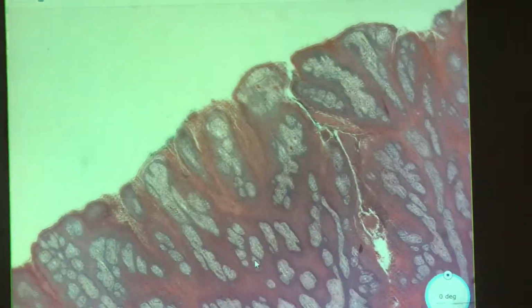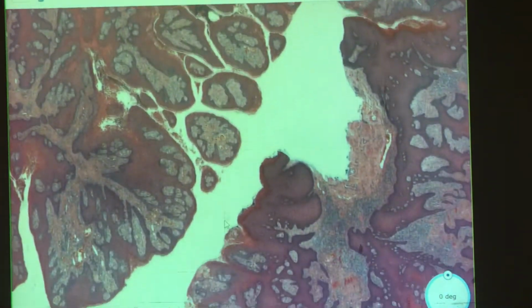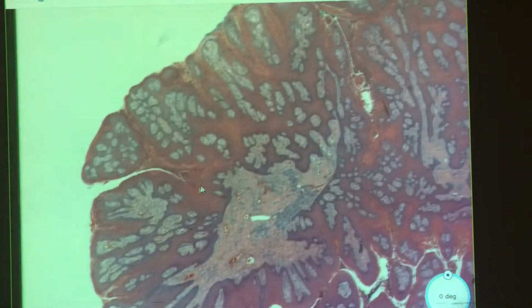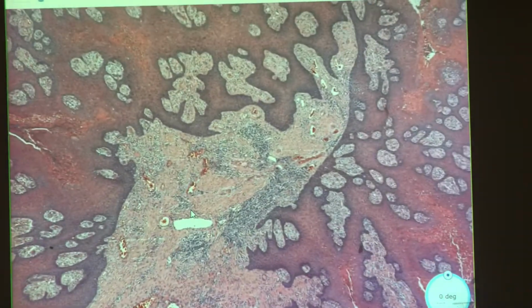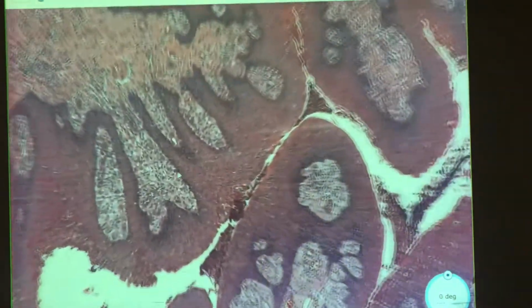Is it the hyperkeratosis? Right, so there's no hyperkeratosis, and you often see like red blood cell extravasation into that as well. And then, going back to our ridges and our papillae, what's really pushing them up and elongating them in this lesion?